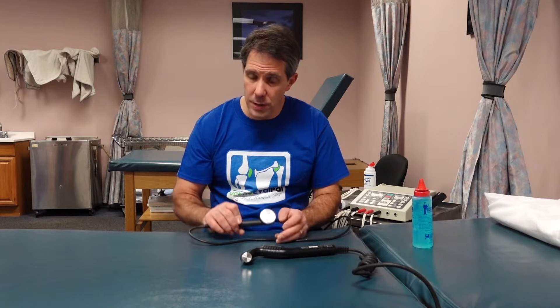Think about the depth of the tissue. Ultrasound cannot penetrate much more than four centimeters deep at one megahertz at two watts per centimeter squared. If you're trying to reach tissue on someone who may be overweight, or targeting something like a facet joint, ask yourself: are you really getting an effective treatment? Remember the depth of the tissue and your parameters when using ultrasound.